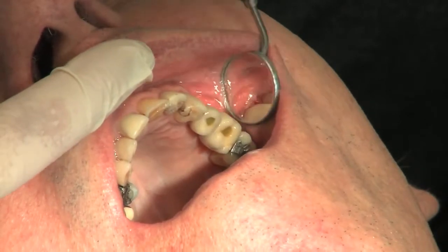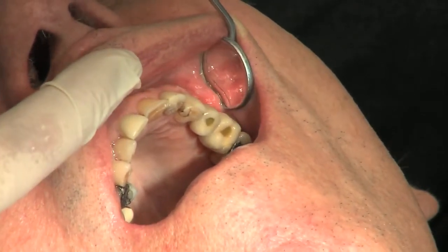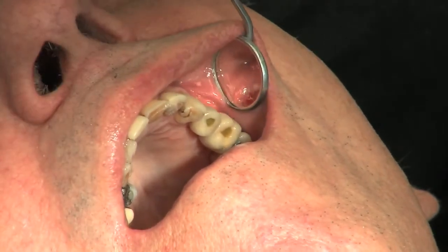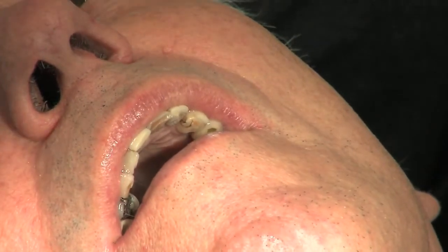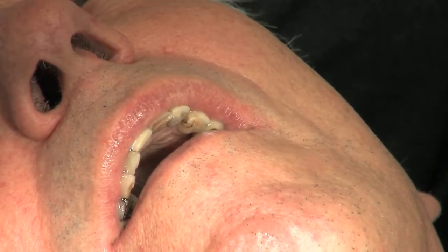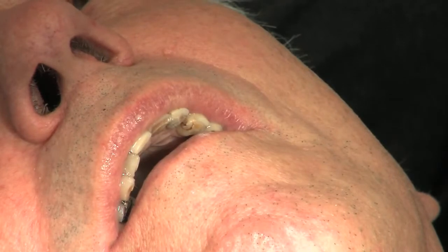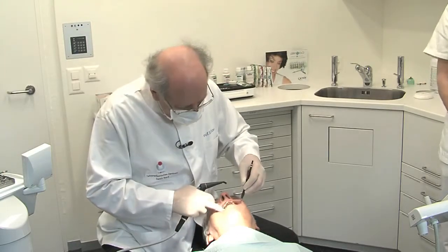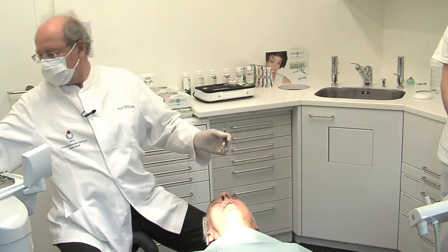When you look at this situation from the back, we had almost no attached gingiva. And when you look at the margin you can see that there are some bleeding points — this is normal, coming from the high pressure of the powder. At the same time, when the situation settles, we will have a small retraction. I like this because it ensures we have minimal pockets, and the biofilm of bacteria cannot really grow.